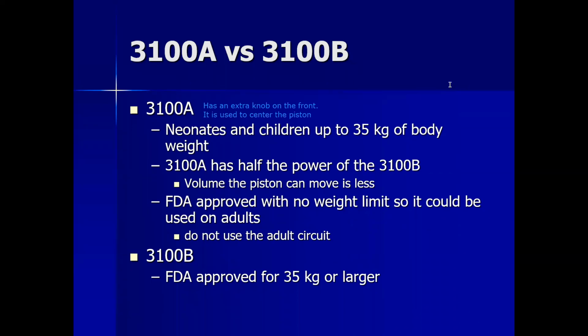We should put that on the back of our t-shirts, right? All the stuff you guys have to learn. Center the piston.